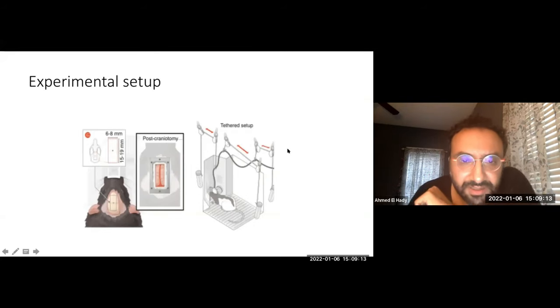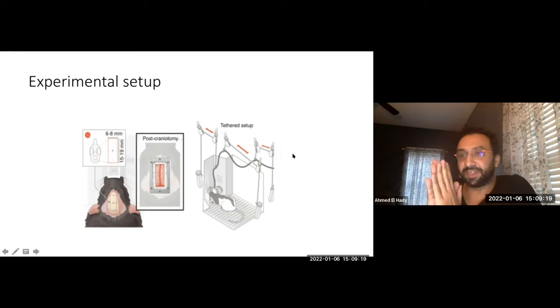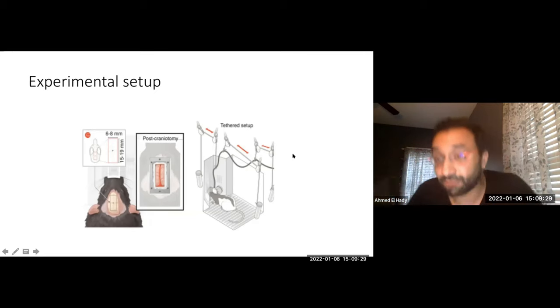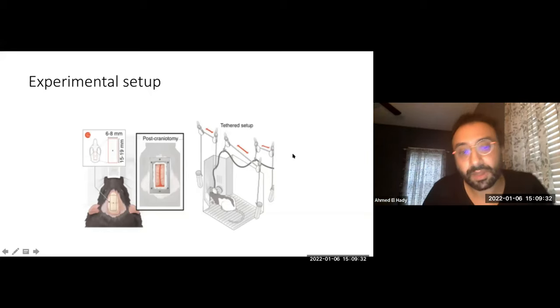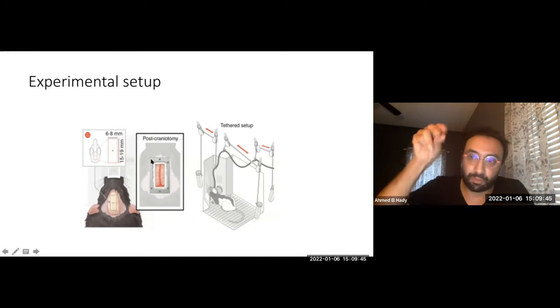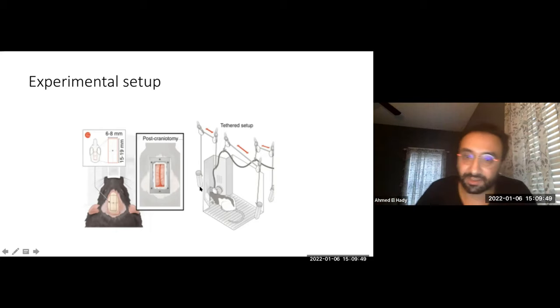Sorry about the pixelation. To give you an idea about the experimental setup: one thing maybe I didn't mention in the marmoset, but I hope it was clear, we have to open a craniotomy, a cranial window, because the ultrasound for now doesn't cross through the skull. In the preparation here, we open a very large craniotomy in the rat, around maximum 8 millimeters by 19 millimeters, so it's almost the whole skull. Then we have a head plate and some probe holder, and then we can have the ultrasound probe in. And I designed a tethering setup that allows the animal to move freely in its cage while it's behaving and while we are imaging.